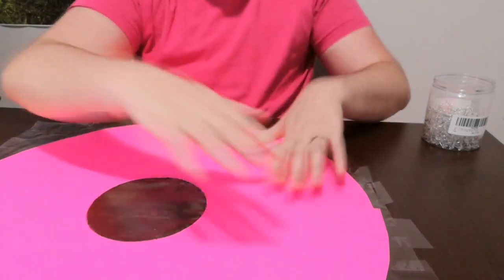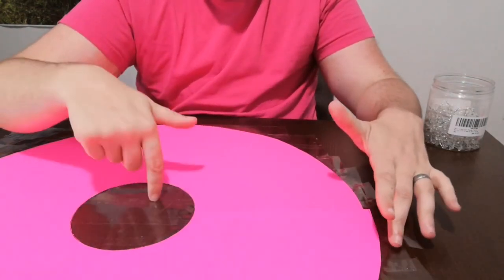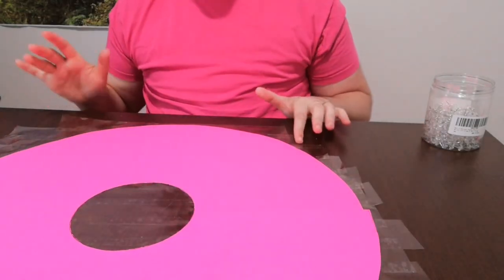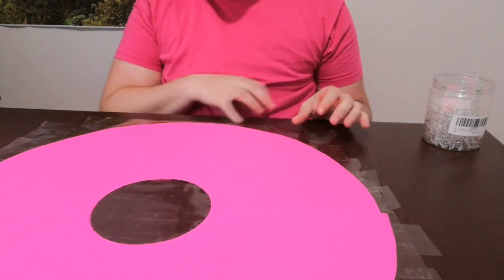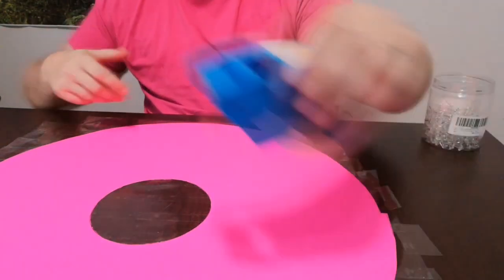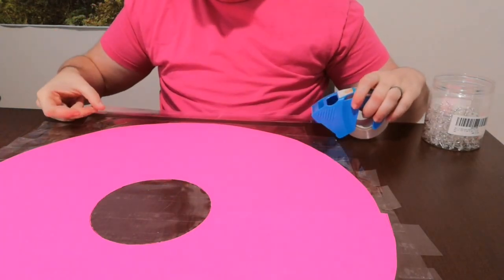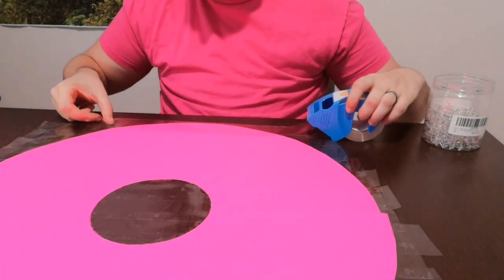So this is the other side — now this is the sticky side. I've just flipped it over, and you just want to go over it. Make sure that it's overlapping on all of the tape so that it creates a seal. Same song, second verse.